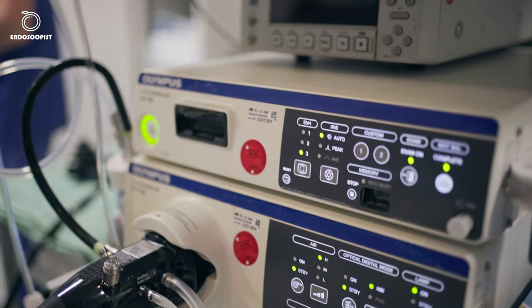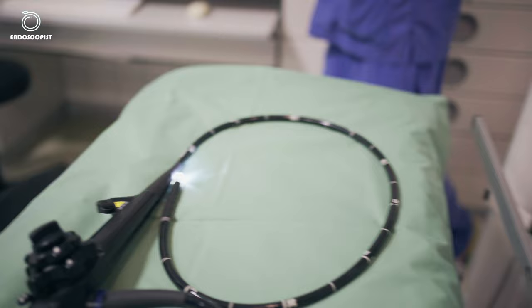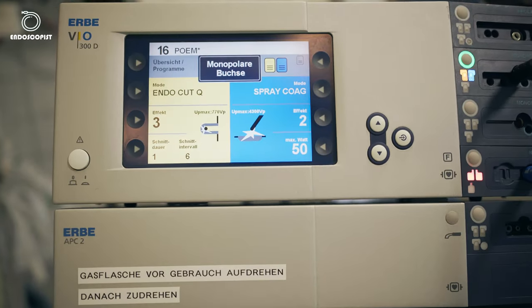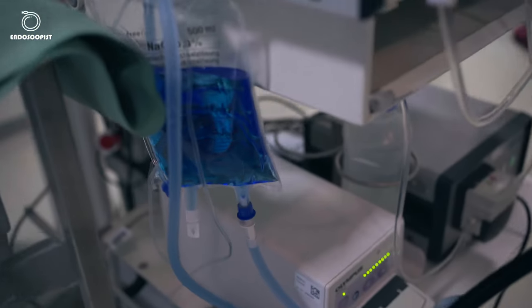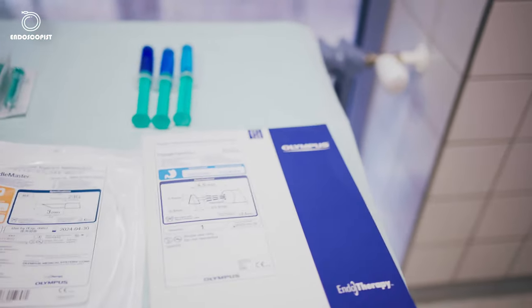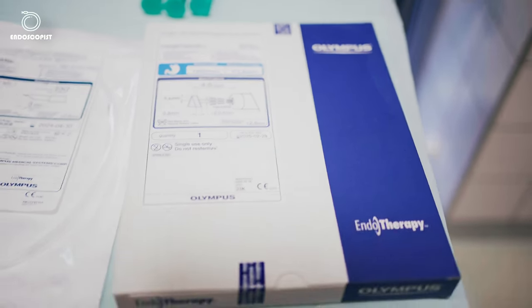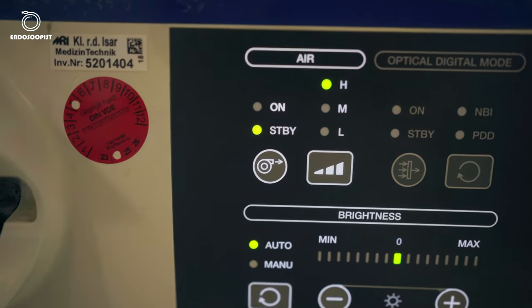My setup for POEM is very simple. I use an upper endoscope, usually Olympus 190. I use an Erbe electrosurgical unit. For injection, I usually use normal saline without adrenaline with some indigo carmine. I try to keep it an ocean blue color, not too dark, not too bright. And the most important thing is to use only CO2 for insufflation in these cases. Never use air. It's very important.